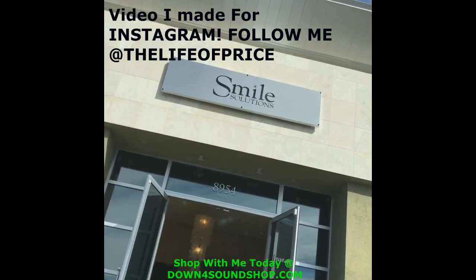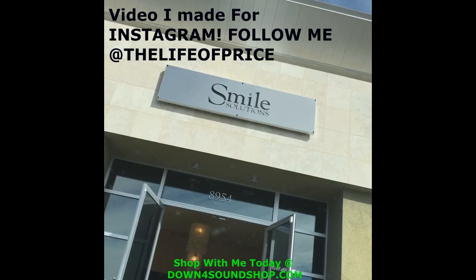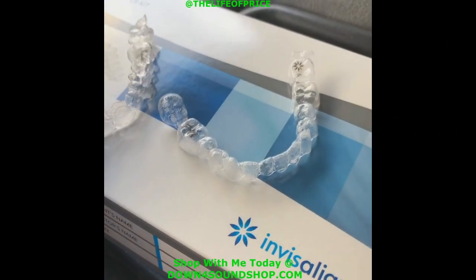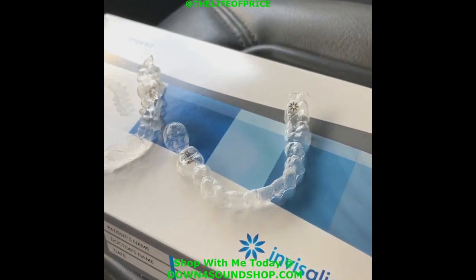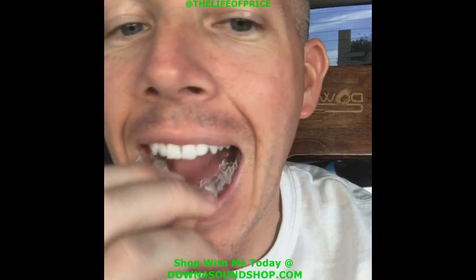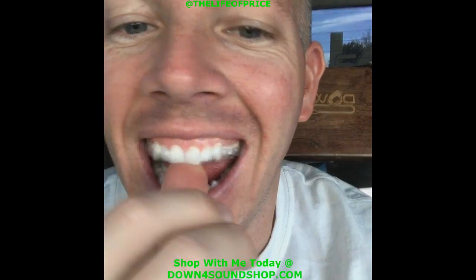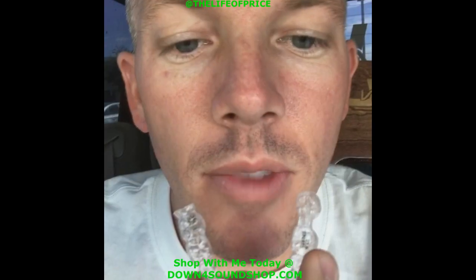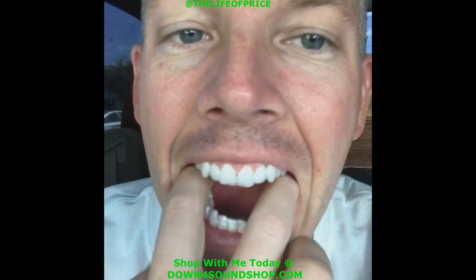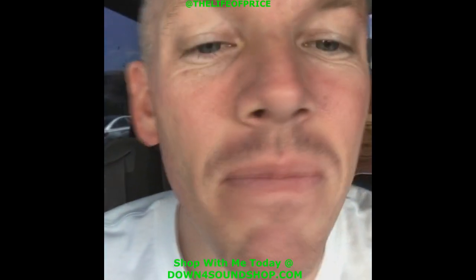What's up guys, here at Smile Solutions, about to go in and get my Invisalign trays. I already had these in, but these are my tops and these are my bottoms. I made a full video that's going to be on my YouTube channel, but I'll show you how they go in real quick. Tops going in. Just like that. Now the bottom's going in. That's it.